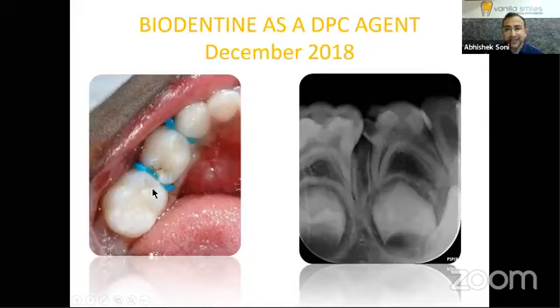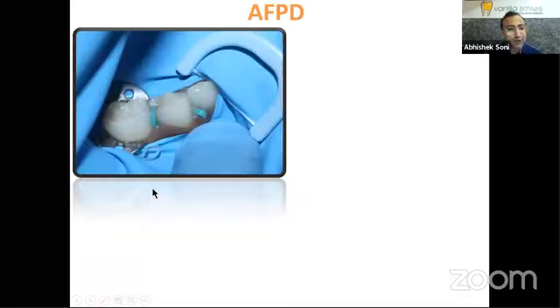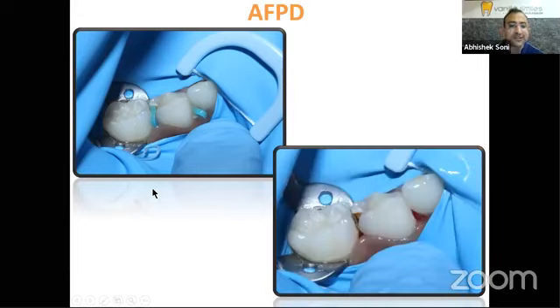Another case of direct pulp capping, wherein we tried to be minimally invasive. These are elastics, which we shall cover shortly in the Hall's technique. So we tried to do an aerosol-free pediatric dental procedure by putting the elastics. But if you see in the clinical picture over here, the elastics have sunk subgingivally, and we could not achieve that kind of separation which we ought to have.